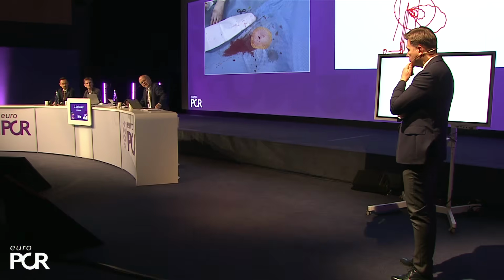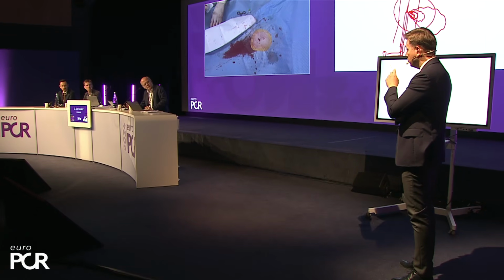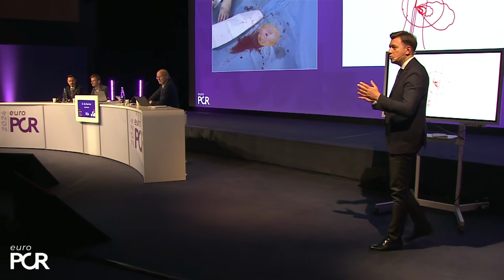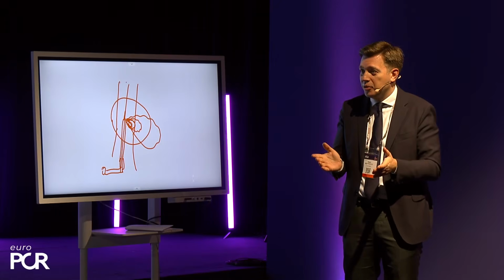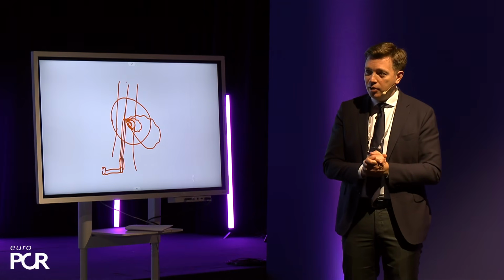But it's really important to be sure that you leave the room with the problem solved if there is any problem. Yeah, we do it from the other side, taking the pigtail down. Routinely? Yeah, routinely. Okay, so that's another insight. So there are these two possibilities, but I think taking the last injection is very important. We need to see the anatomy before the final closure.